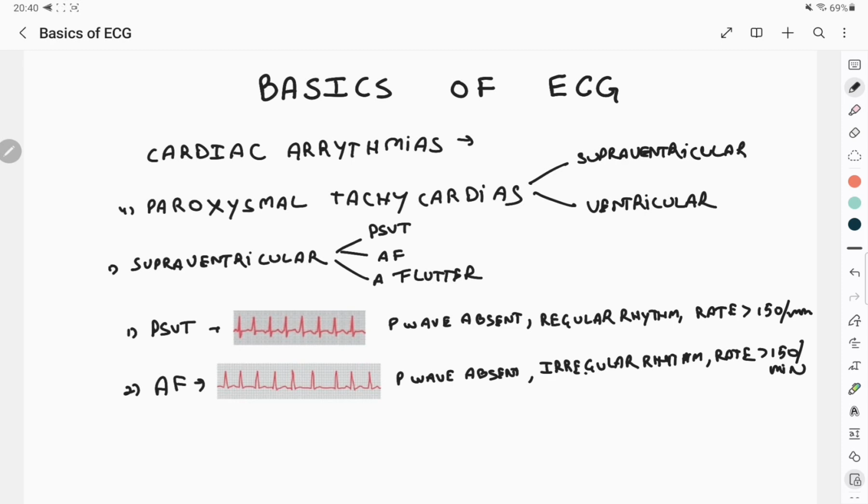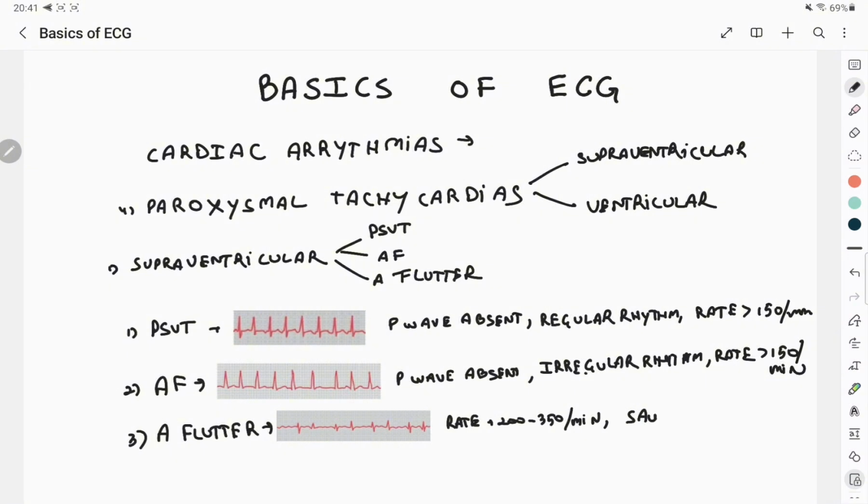The atria stop pumping actively, however, blood still drains passively down into the lower chambers, meaning ventricular pumping efficiency drops by only 20 to 30%. In atrial flutter, the atria beat at a rate of 200 to 350 per minute. The AV node cannot pass signals that fast, so it lets only one every second or third wave through. The ECG features a classic clean, sawtooth pattern of P waves with fixed ratios of ventricular responses.